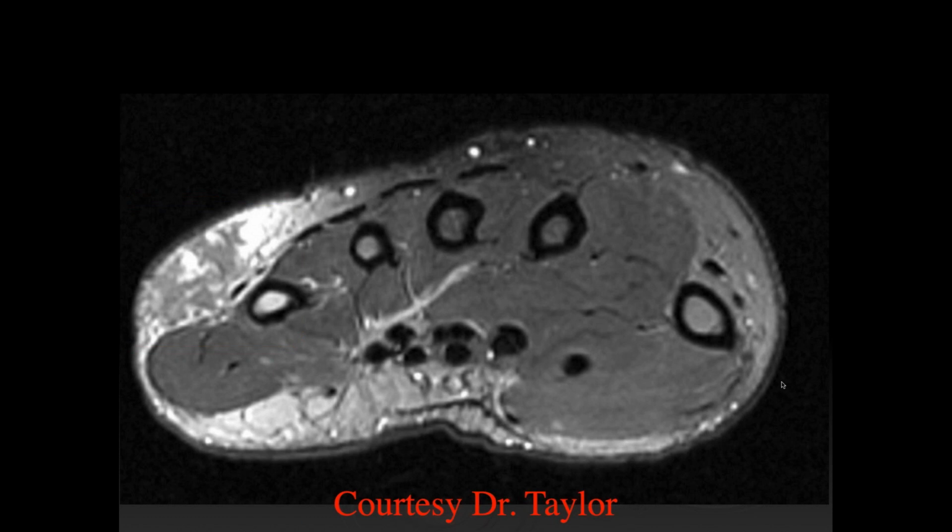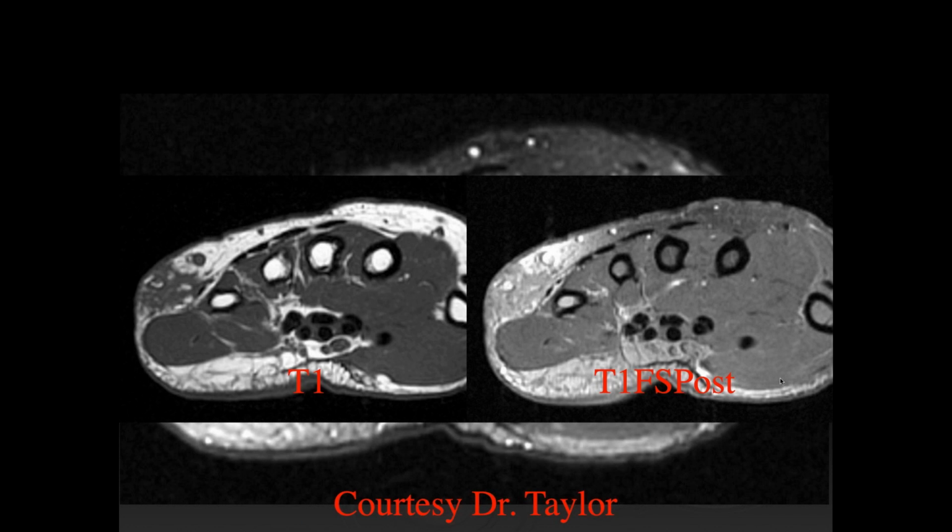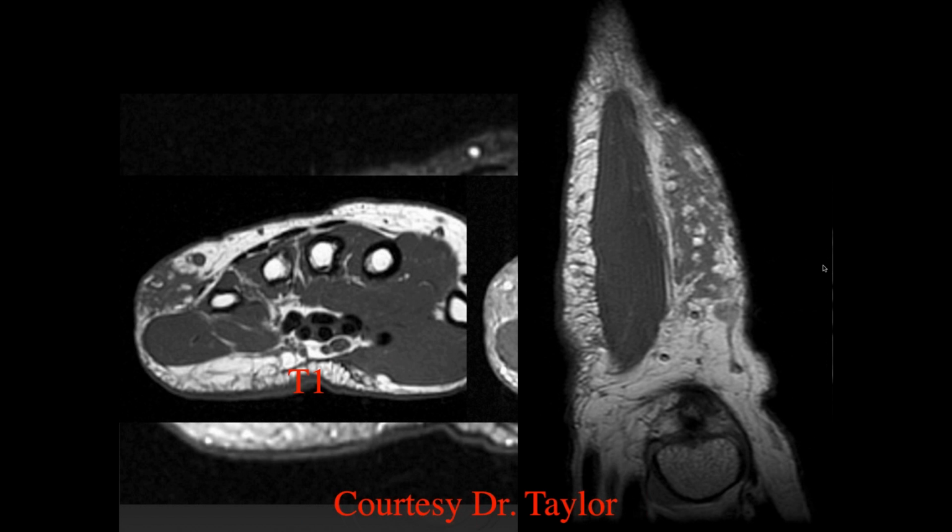Okay, so here I see some soft tissue swelling and edema within the subcutaneous tissue, and it looks like it's low signal intensity on T1 images, and there's some mild enhancement on the post-contrast images. I'm not sure if this is cellulitis. Jennifer, it's a hand. Don't forget to tell us. The hand, yes. Yeah, we have infiltration of the subcutaneous fat. I would ask if there's a prior trauma in this region or no trauma. I'm not sure. Diffuse is a little bit more focal. This is sarcoidosis. Oh, sarcoidosis.